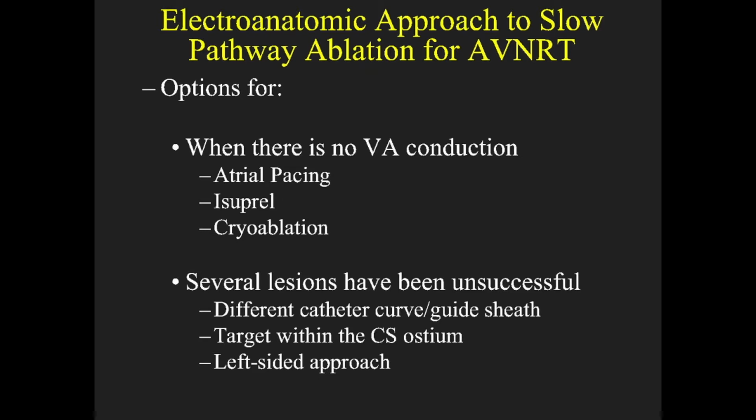What do you do in the following scenarios? What if there's no VA conduction? Particularly with atypical AV nodal reentry, there may not be VA conduction. Some patients don't have VA conduction at baseline without inducing them with isoprel. It's difficult, I think, to ablate during isoprel. I would prefer to wait till the isoprel washes out.